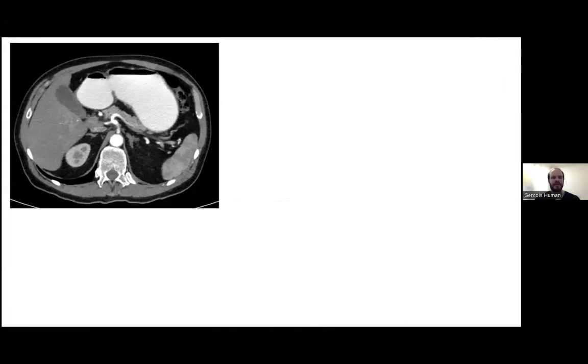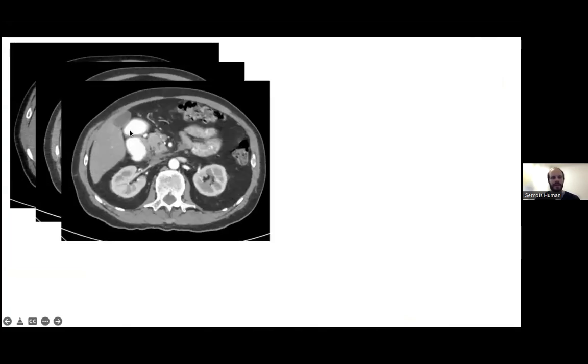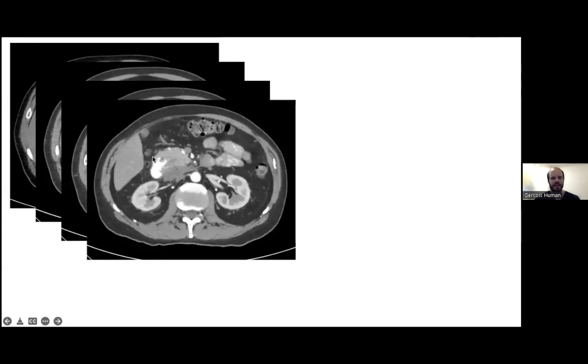As you can see, there is very bright contrast in the aorta and also the celiac axis already. As we come down, we start seeing the pancreatic head, around about there. Still not really seeing anything specific. We are still seeing some low density in this pancreatic duodenal groove region.